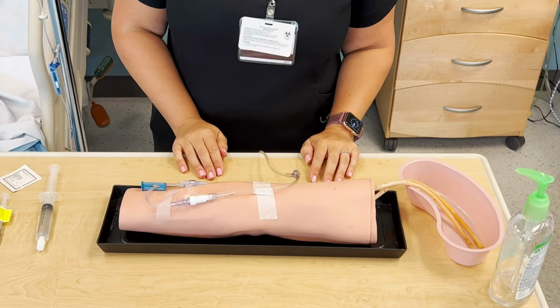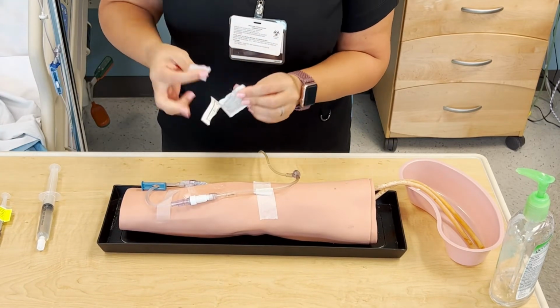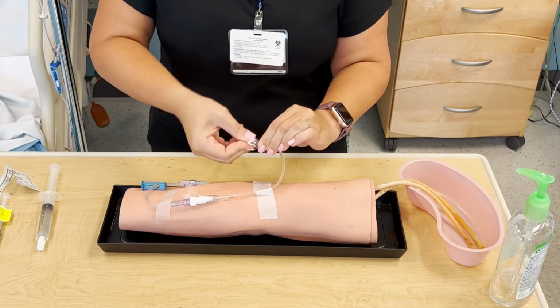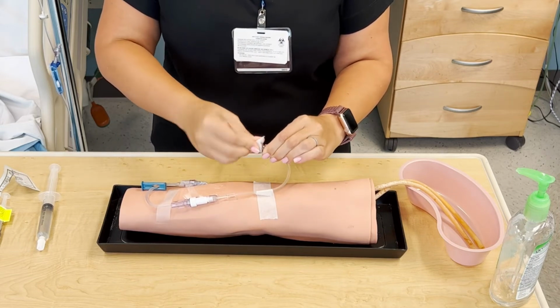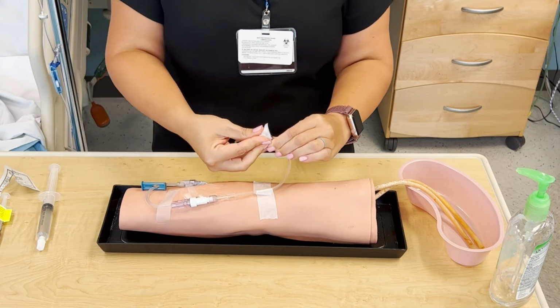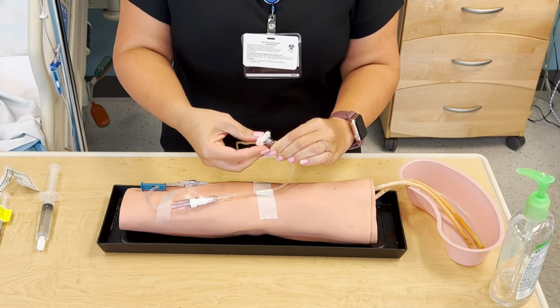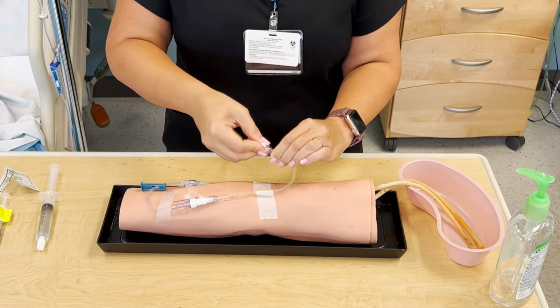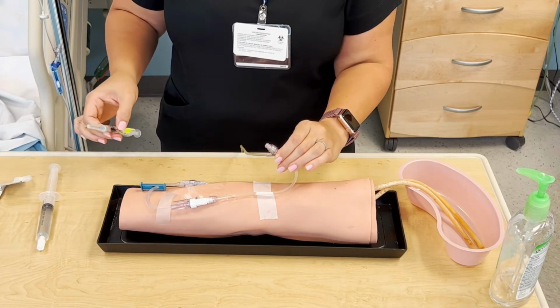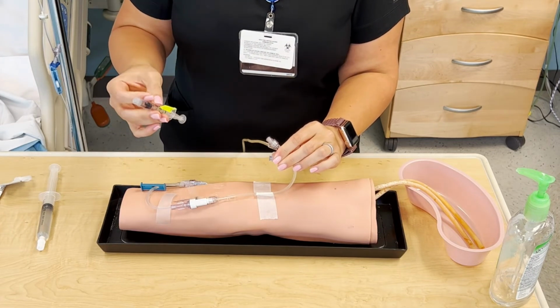Check your hospital policy to determine if you need gloves for this step. We are going to clean the port closest to your patient's IV site for 15 seconds vigorously. And keeping this in your hand, make sure not to drop it so you maintain your sterility. Take the needle off of your medication.